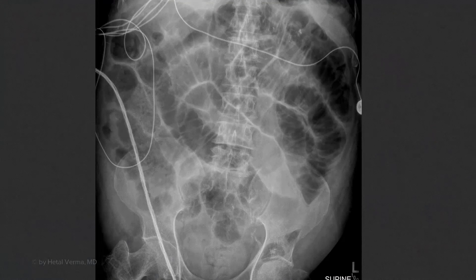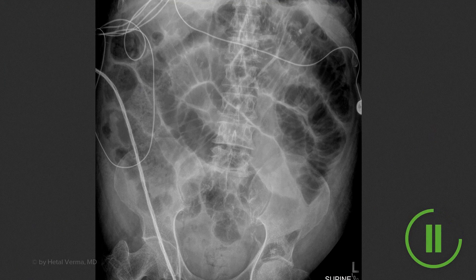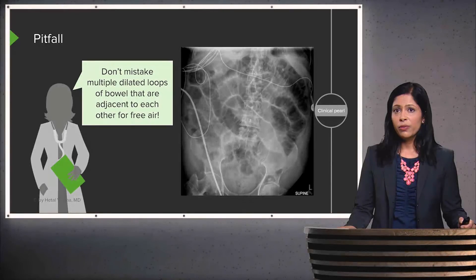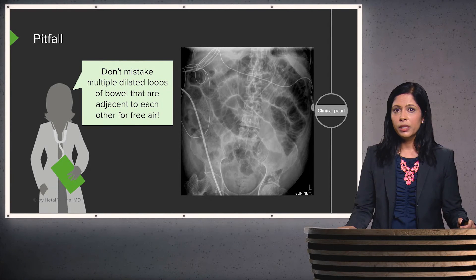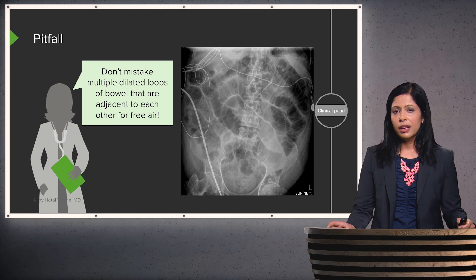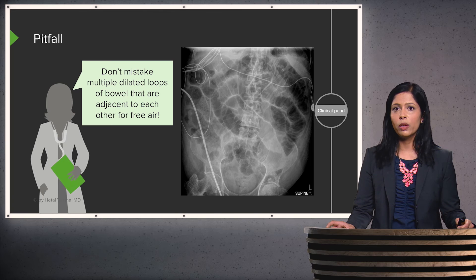An important pitfall is not to mistake multiple dilated loops of bowel adjacent to each other for free air. This patient has multiple dilated loops of bowel, likely representing small bowel obstruction. You can see bowel wall adjacent to air within the bowel, which could be mistaken for the Riggler sign. If there is any confusion, the next step is to perform a CT to determine if there is truly free air or whether this represents small bowel obstruction.